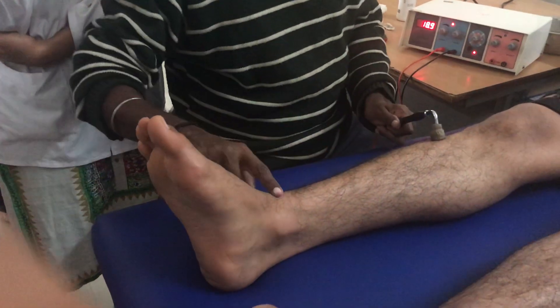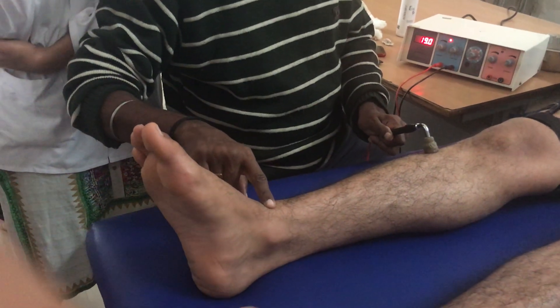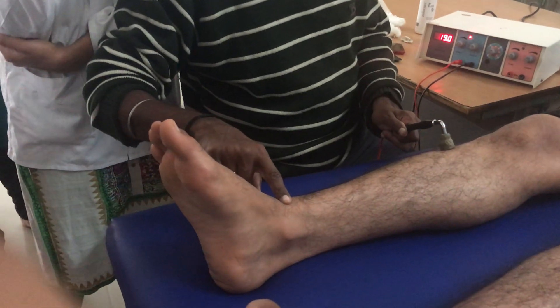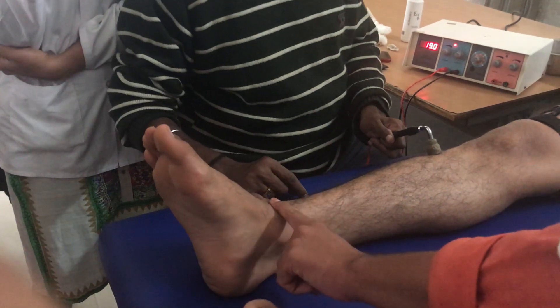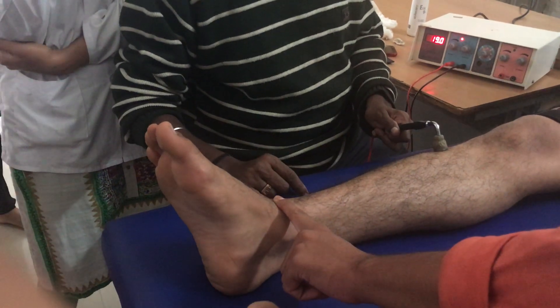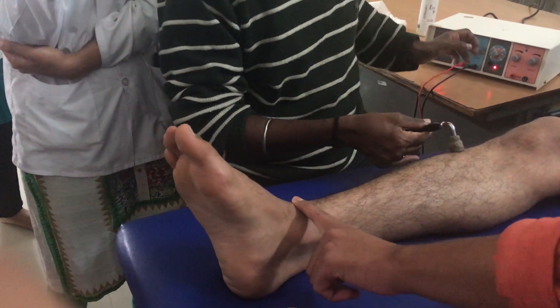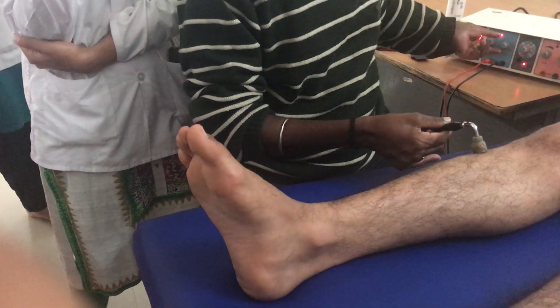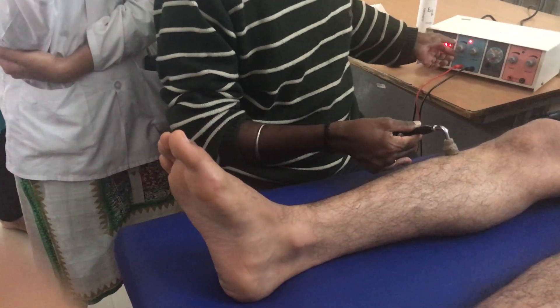It started to respond. Please palpate — it is almost the same strength as the earlier one. I am getting 19.1mA. Now going to the final available duration, which is 0.01ms. Is it responding? No — it stopped responding again.